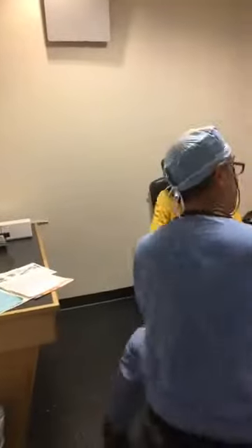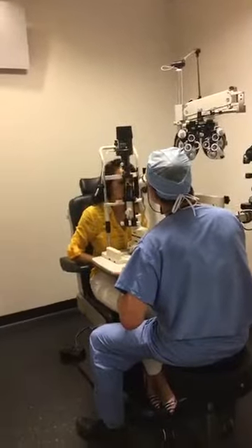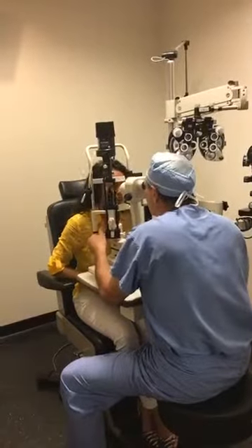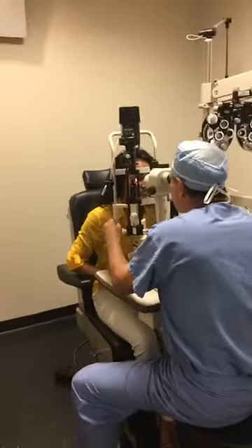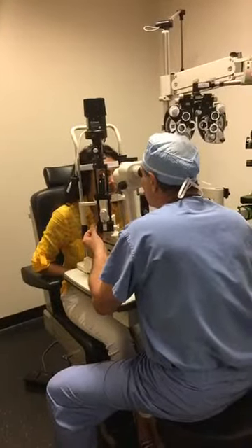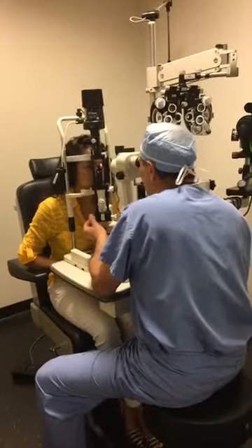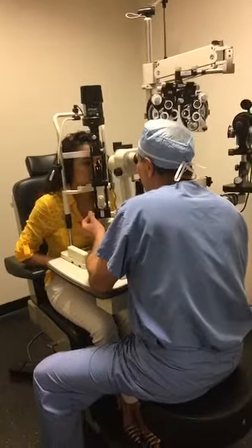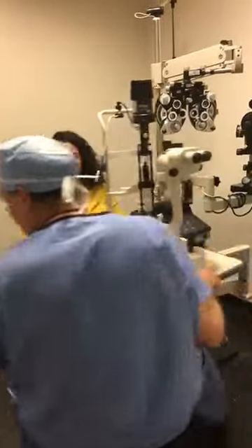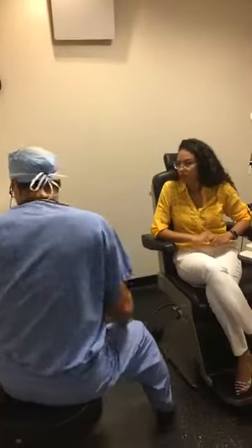Let's take a look. You can take your glasses off. Excellent. Is that comfortable? Yes. I know, it's really bright, I know. That's good. Perfect. Cornea looks really good. Again, no dry spots. Your eyelids and lashes, everything looks good. And I know Dr. Catanzaro got a good look at your retina and everything looks good there. Most importantly, everything looks great.